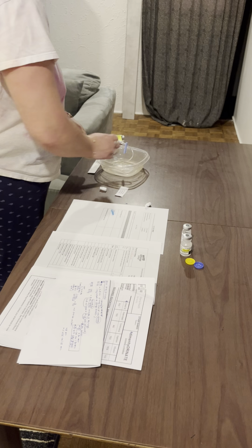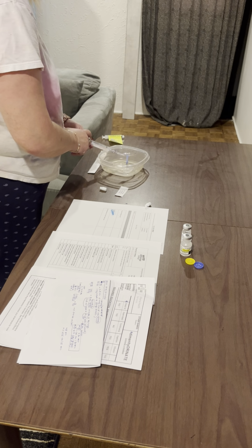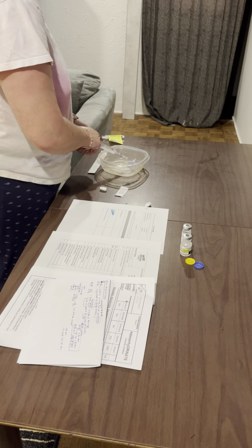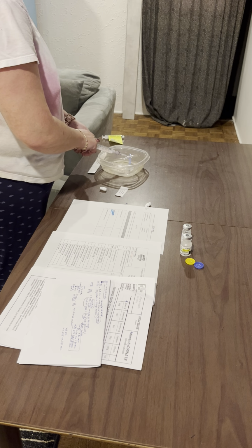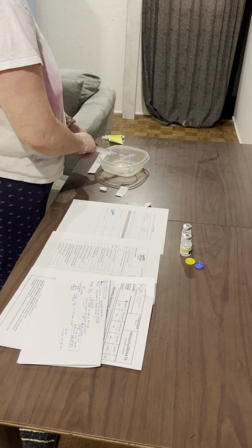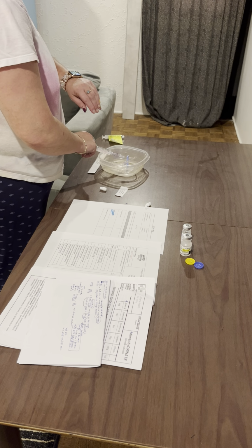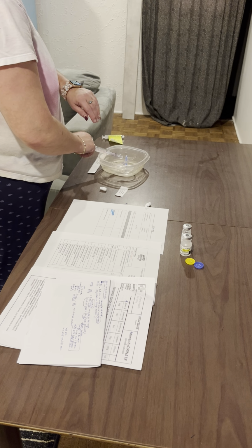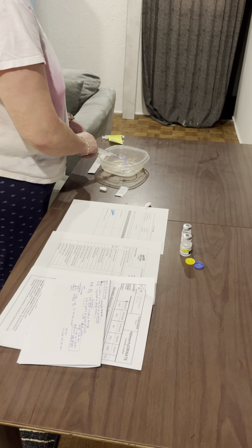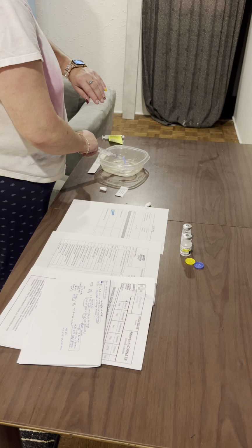Okay. So what we're going to do with this one here is give 1 mil every 30 seconds for 3 cycles. So we'll start and we'll go up to 9, and we will wait 30 seconds. And then we'll go up to 8 and wait 30 seconds.